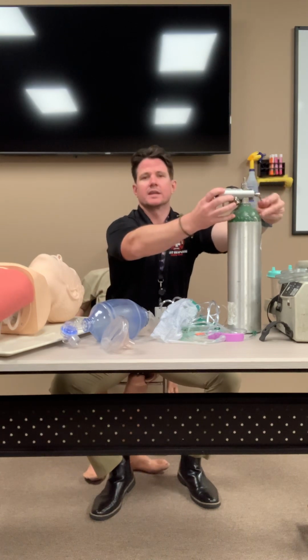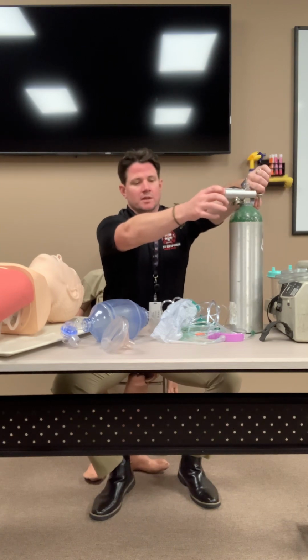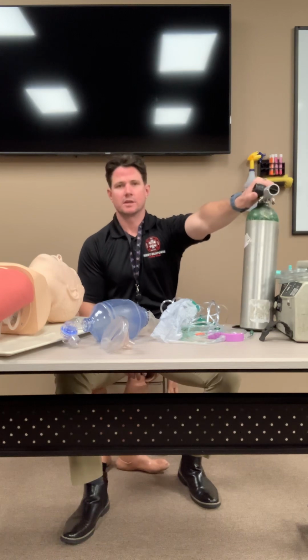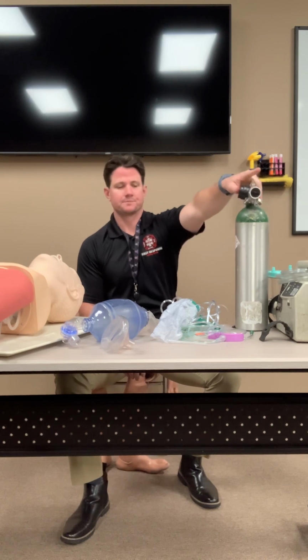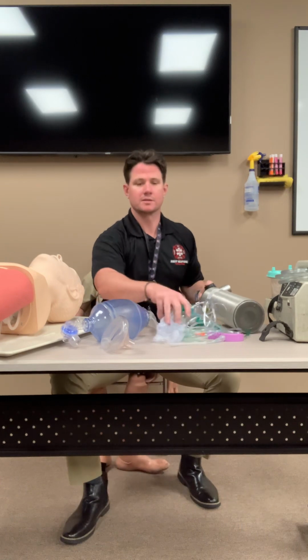So I'm gonna leave this connected for the BVM example, all right? That in a nutshell is your oxygen setup and administration, all right? Everything I stated, you're gonna wanna verbalize, okay?